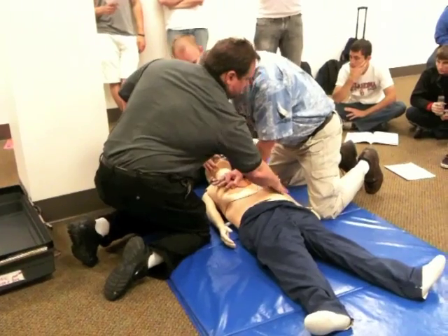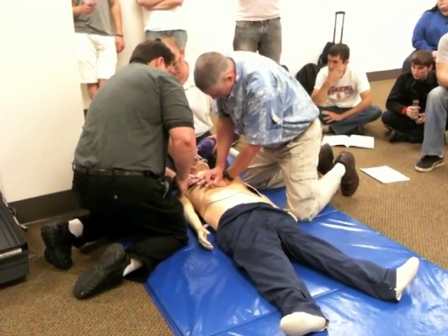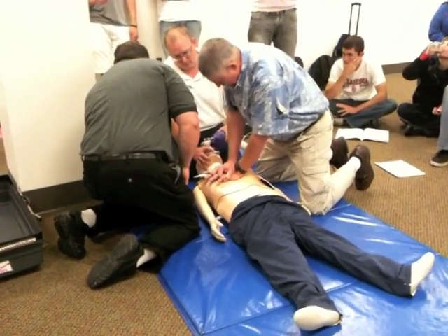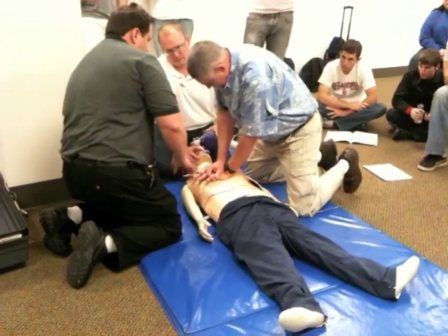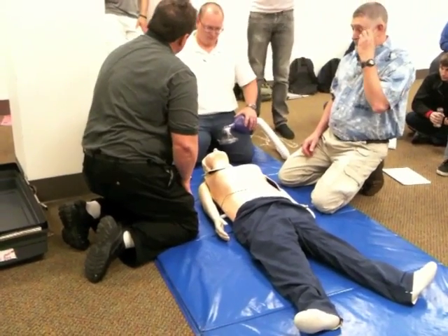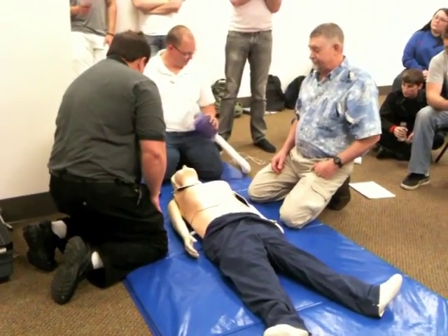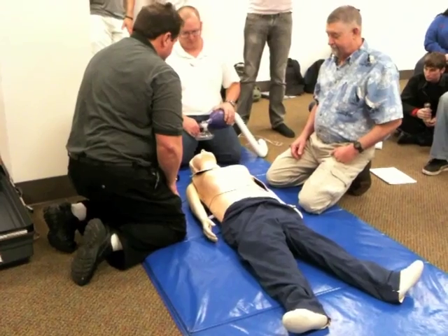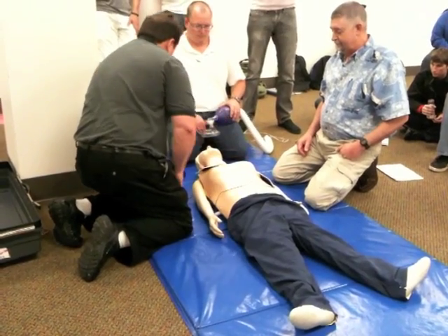I got to him as soon as I saw him fall. Pull the red handle to open the back. Look at the pictures on the pads and peel one pad off. Do not touch the patient — clear the patient, please. Evaluating heart rhythm. We've got oxygen on at 15 liters. Preparing to shock. Everyone clear. I'm clear, you're clear, we're all clear — clear!